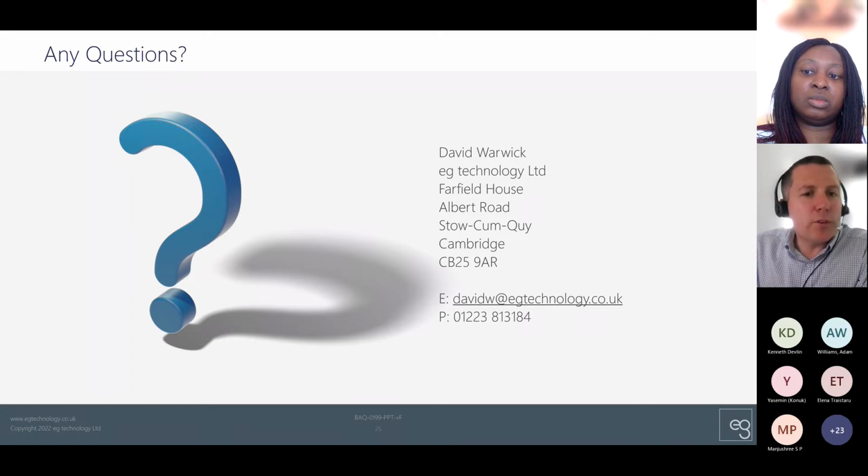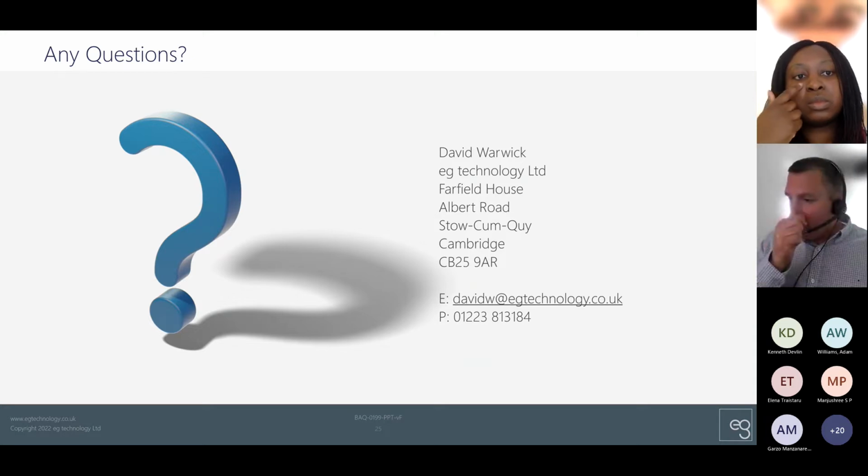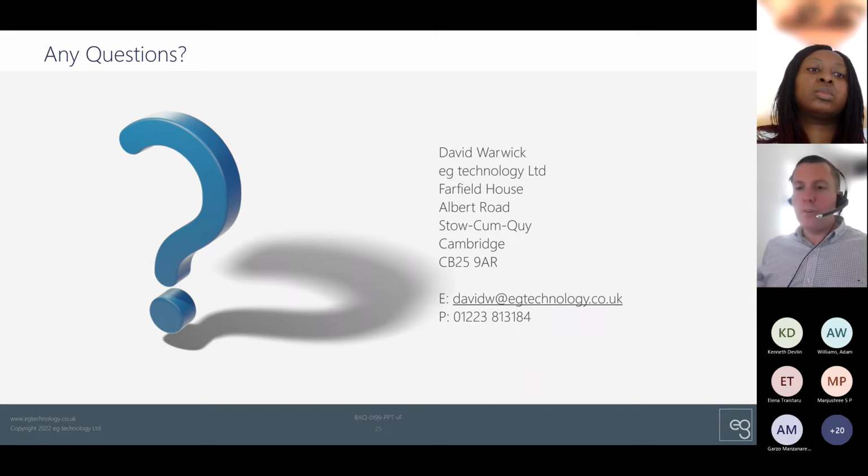So yeah, it all ultimately comes back to the risk. If it's decision support, when the clinician sees the information that you provide, what are the actions that they're going to take, and if that answer is wrong, incorrect in one way or the other, what does that action or that resulting inaction cause? And as I said earlier, are there other aspects? If you have a blood test, if it's repeated in 2 weeks and it gets picked up, is that going to be okay?